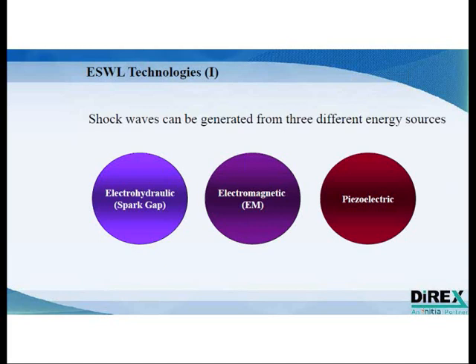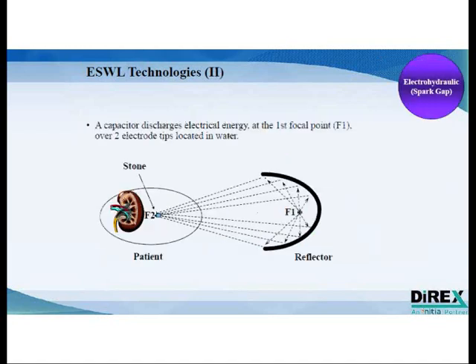The piezoelectric on the right is the least used technology, today only used by one company. It is not a popular technology and has not really had much success historically. So the main two technologies to be seen in the markets today are electrohydraulic and electromagnetic.